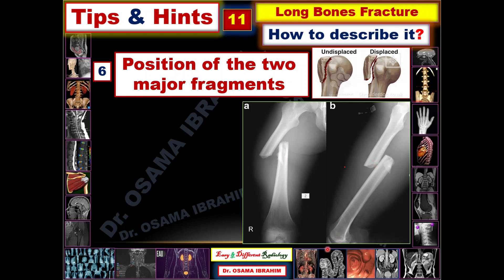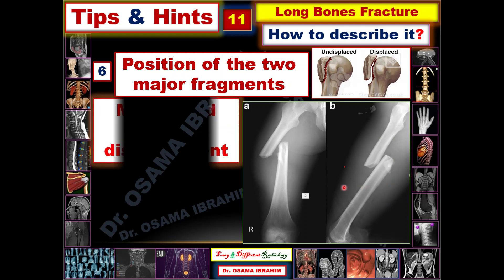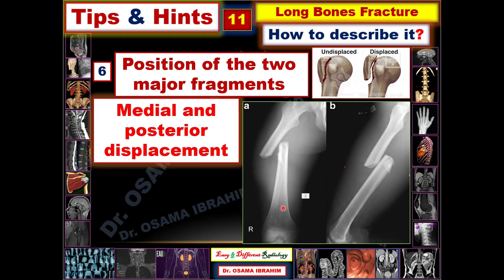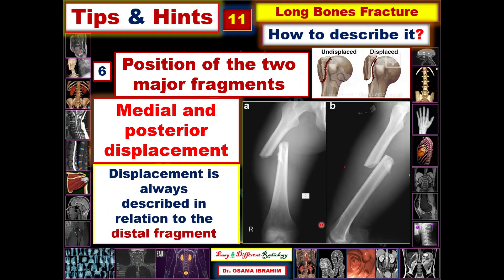Looking at the lateral view — this is the patella, so this is the anterior aspect and this is the posterior aspect — the distal segment is displaced posteriorly. To describe the position of the two major fragments here: this is a displaced fracture, with medial and posterior displacement of the distal part of the fractured femur. Displacement always describes the relationship to the distal fragment, so you always look at the distal fragment and note its displacement medially or laterally on the AP view, and anteriorly or posteriorly on the lateral view.